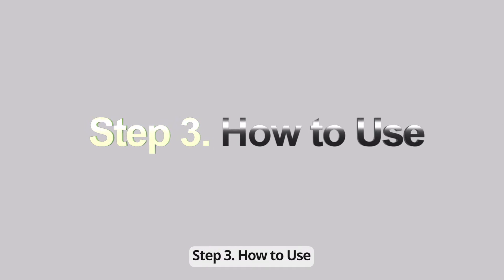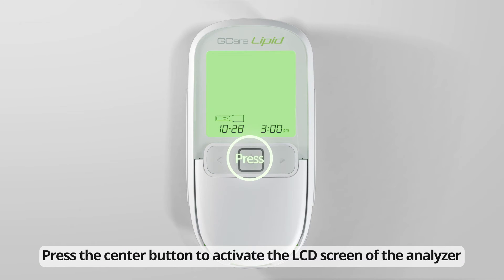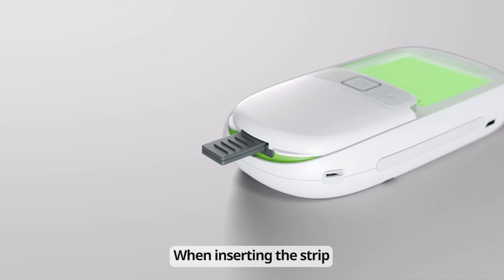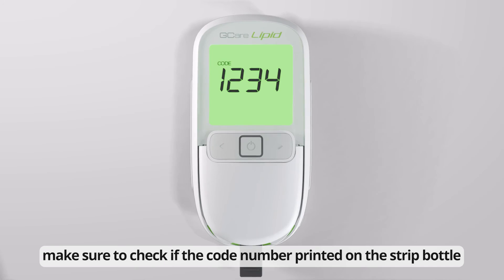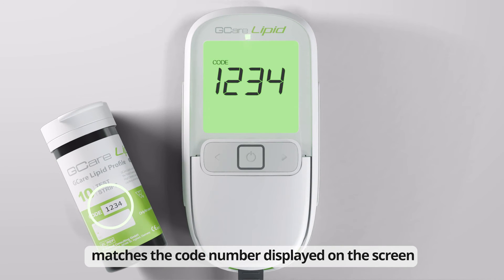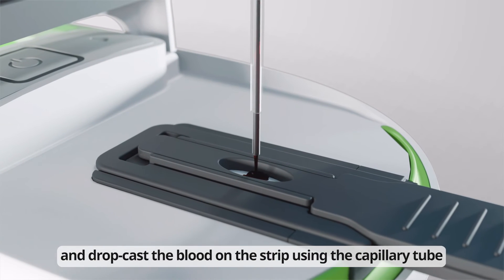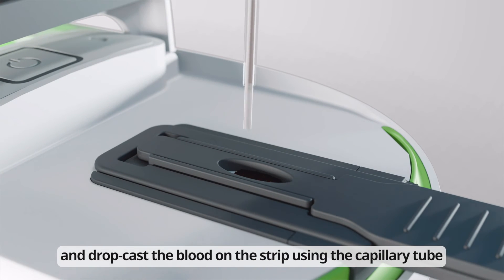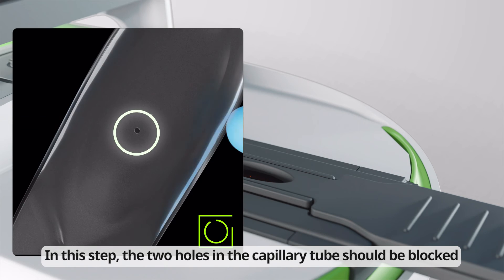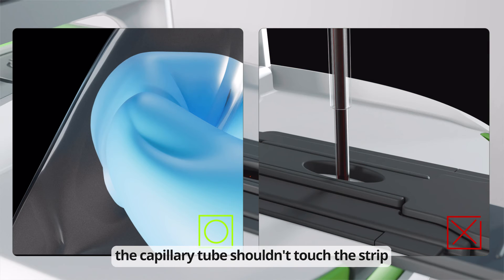Step 3: How to Use. Press the center button to activate the LCD screen of the analyzer. Insert the strip. When inserting the strip, make sure to check if the code number printed on the strip bottle matches the code number displayed on the screen. Open the analyzer cover and drop cast the blood on the strip using the capillary tube. In this step, the two holes in the capillary tube should be blocked, and when drop casting the sample, the capillary tube should not touch the strip.